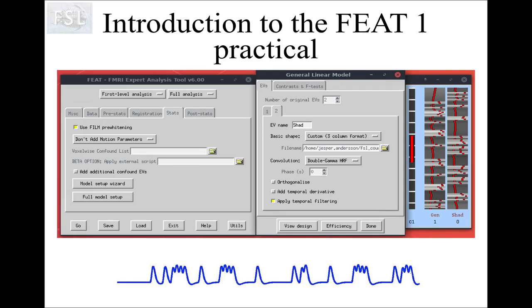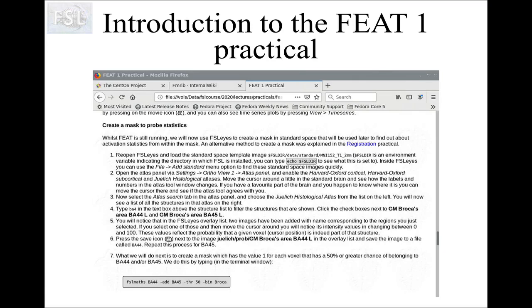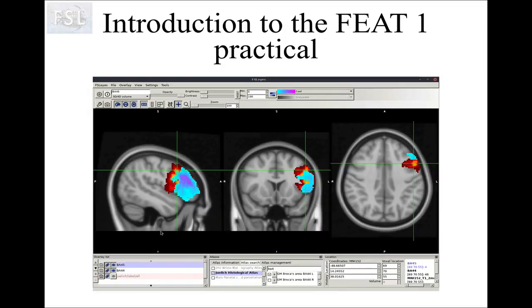The next thing to mention is the creation of a mask that you will use as a region of interest for FEAT query, which is where you visualize and see the results of your study. Just follow the instructions. What I've done here is used the Juelich histological atlas, picked Brodmann area 44 and Brodmann area 45 on the left-hand side, and saved them as BA44 and BA45 as instructed in the practical.